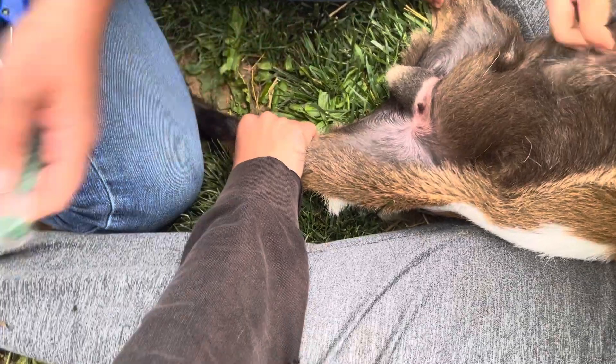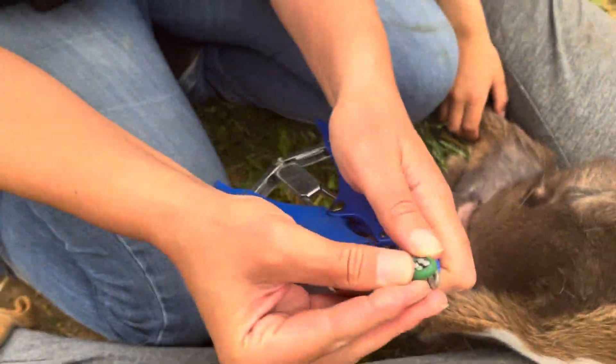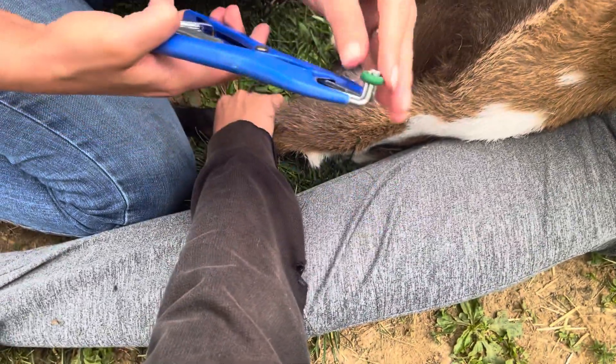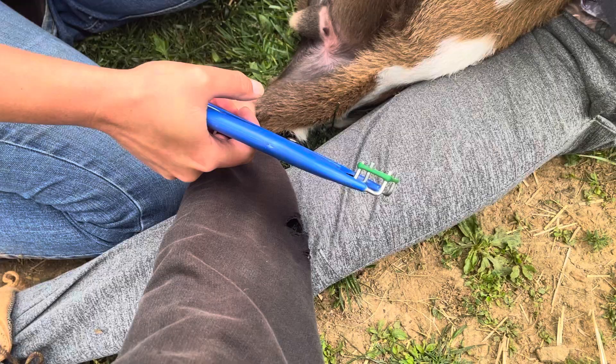On occasion we have a misfire. So we're going to apply the band to the end of the gun. I don't want it to slip off there. Stretch it out a little bit.